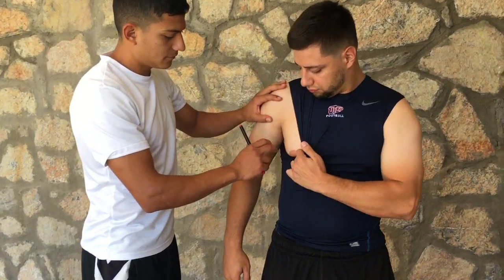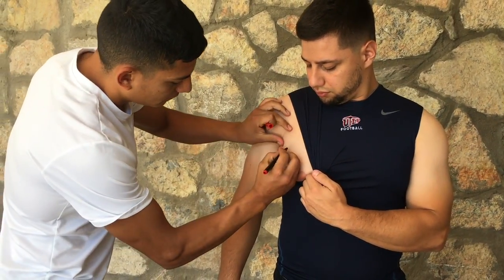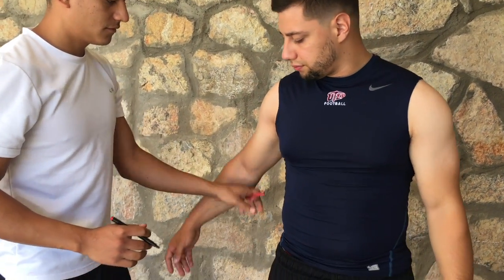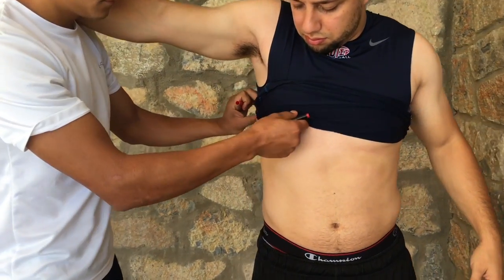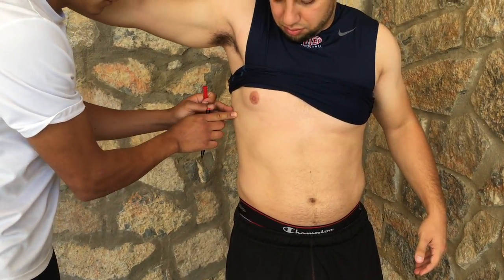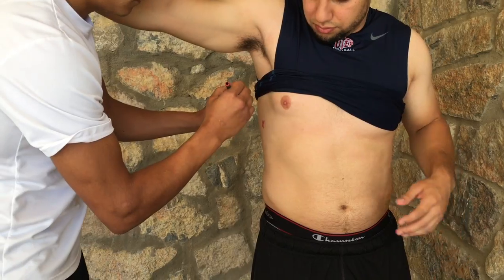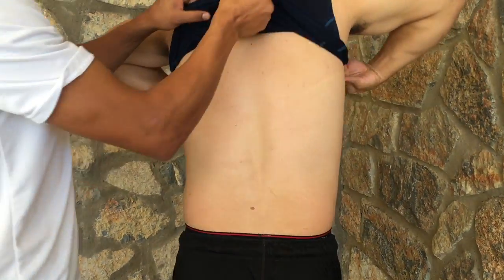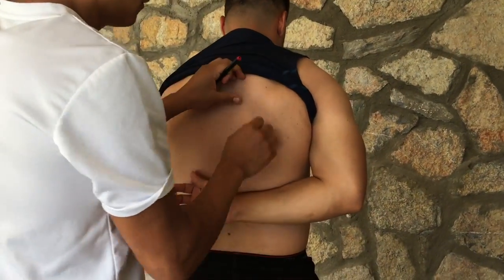The chest pectoral site is 1/2 the distance between the anterior axillary line and the nipple for men, or 1/3 of the distance between the anterior axillary line and the nipple for women. The mid-axillary is on the mid-axillary line at the level of the xiphoid process of the sternum. An alternate method is a horizontal fold taken at the level of the xiphoid sternal border in the mid-axillary line. For women, you might need to move clothing out of the way to obtain a reading.